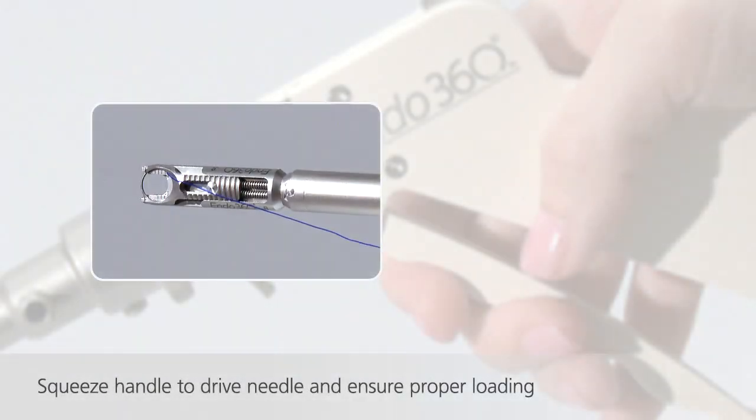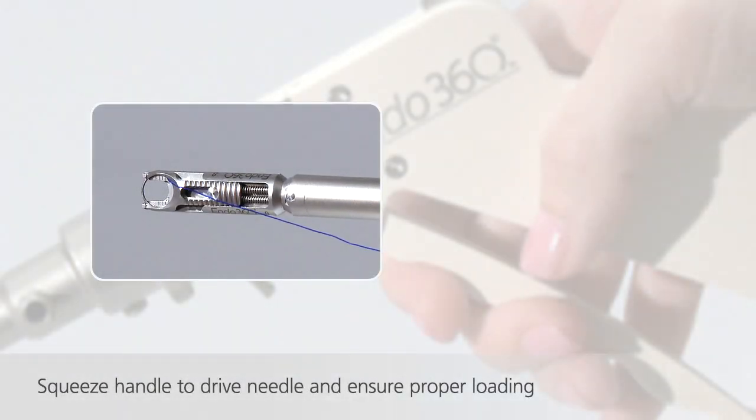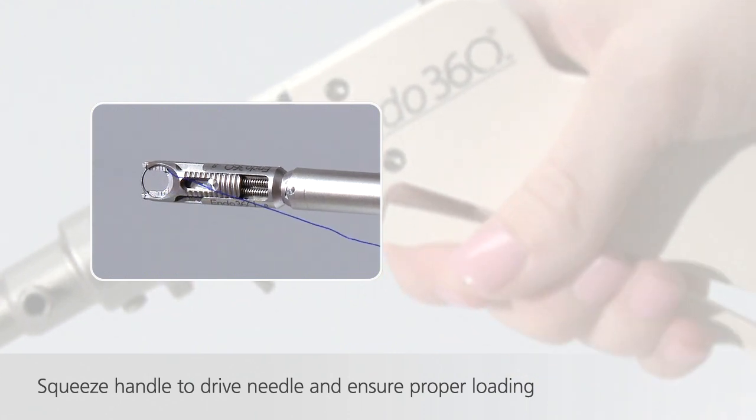Squeeze the handle several times to ensure that the needle is properly loaded and that the device is properly functioning.